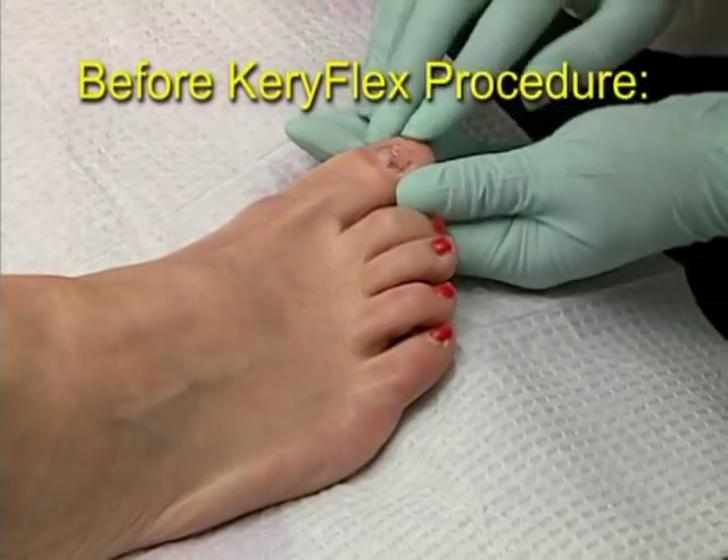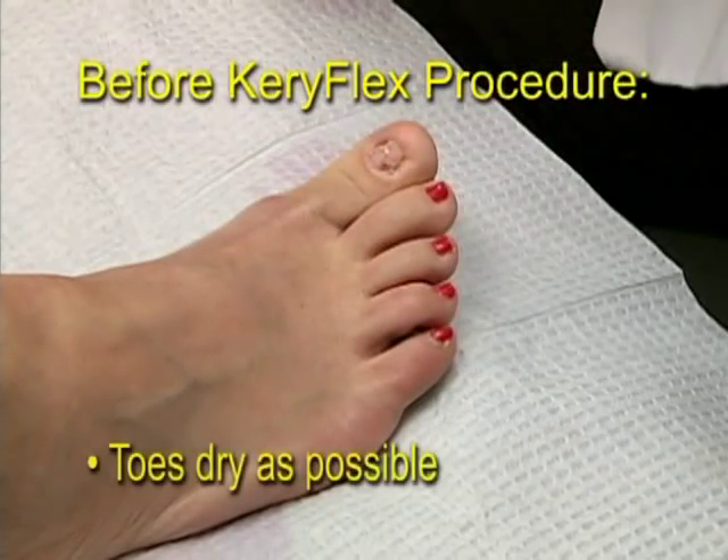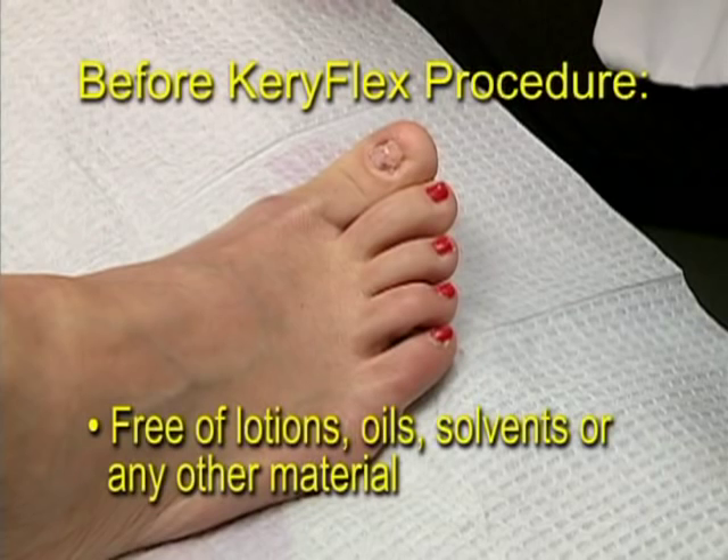Before the Keriflex procedure, you should check that the patient's nails and toes are as dry as possible, and free of any lotions, oils, solvents, or any other substances that might hinder the bonding of the resin to the toenail.